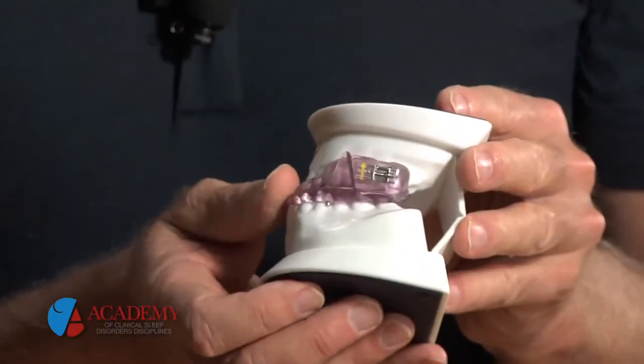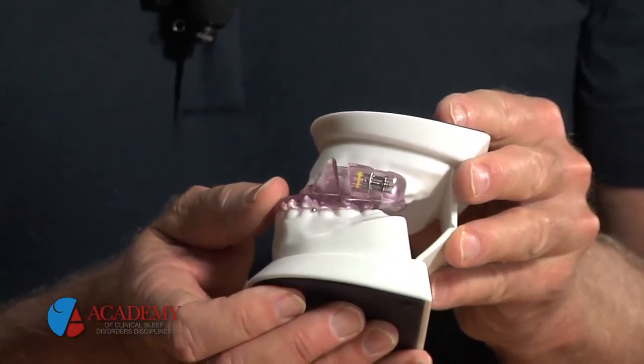But it will have an adjustment, so we will start with a jaw position that's relatively mild and make sure we establish comfort for the patient, because if they're not comfortable, they're not compliant, and it's not going to be effective. It's like wearing eyeglasses. If you're not wearing them, they're not effective. So we establish that first, and then the appliance is adjustable through this mechanism, where it can be adjusted as little as 1/10 of a millimeter at a time, so that we can gradually work to find the most effective position for the patient.